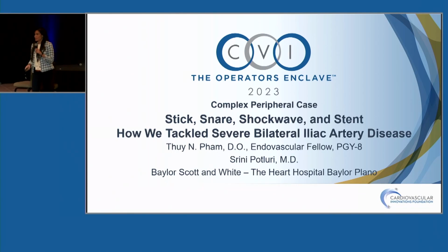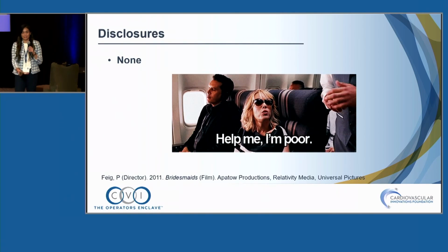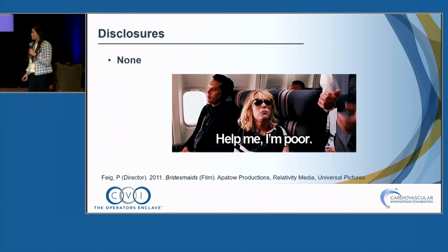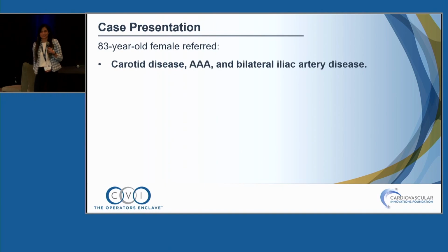I will spare you guys the reintroduction this time, but I will thank you for letting me share a second case. As Dr. Lee said, stick, snare, shockwave, and stent, how we tackled severe bilateral iliac artery disease. I still have no disclosures, but maybe after today I can remove this GIF from my presentations.